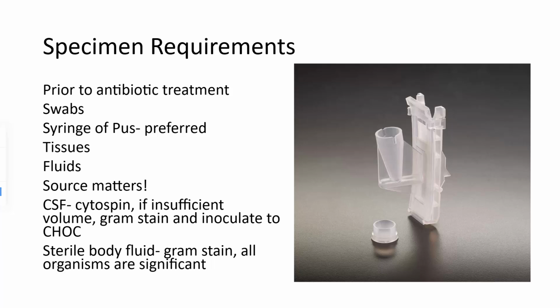You can do swabs, but the problem with swabs, so if you have like, let's say there's a boil on the surface of someone's skin and you want to see if there's bacteria in there. What type of bacteria is growing inside of that boil, you would have to take the swab and get it into and underneath the skin to get to the pus region of the boil. If you just try to scrape the top surface of the skin, you're going to get a lot of contamination with Staphylococcus epidermidis, and that's your normal skin bacteria, and that's going to falsify the results.